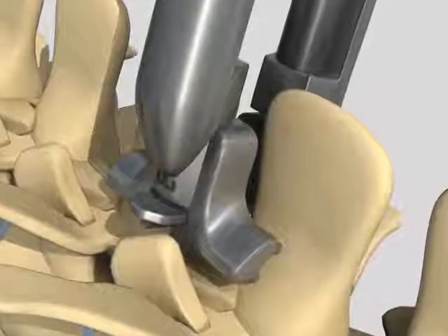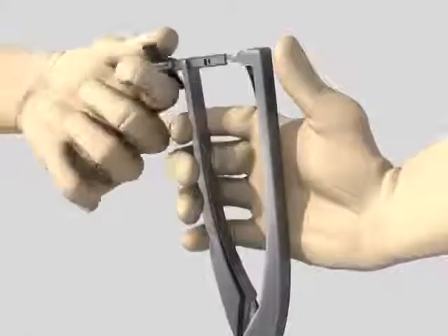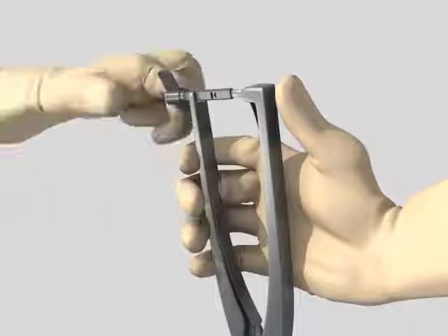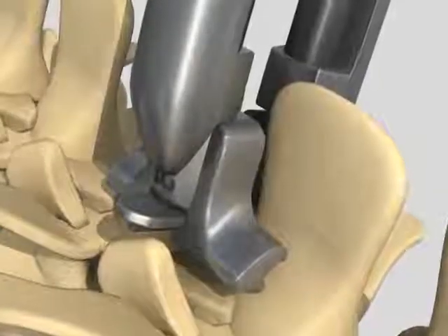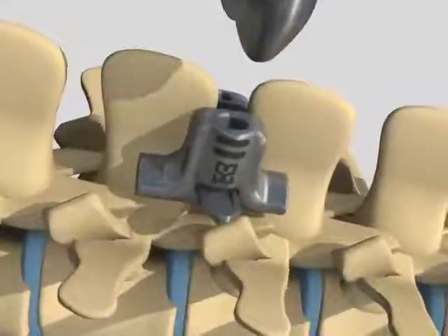In most cases, the incorporated hand compression system is sufficient, but if needed, we have also designed in a threaded wing nut screw for adding more compression, eliminating the need for additional instrumentation, which further reduces overall procedure time.